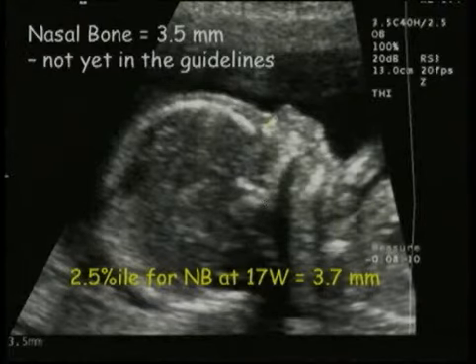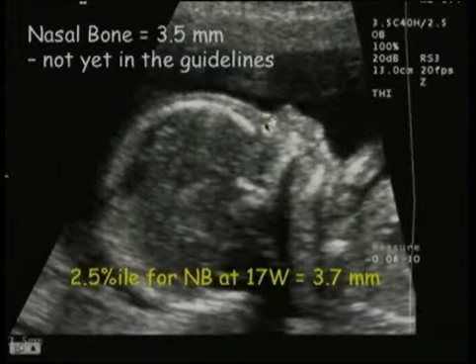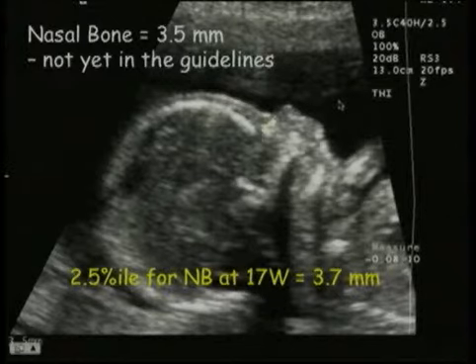The nasal bone is not yet in the guidelines, but it is something that is becoming more commonly done, and we do it on all of our patients in our lab for the risk of aneuploidy and Down syndrome specifically. You can see that this is the chin of this fetus.